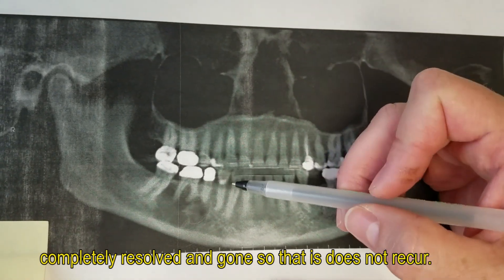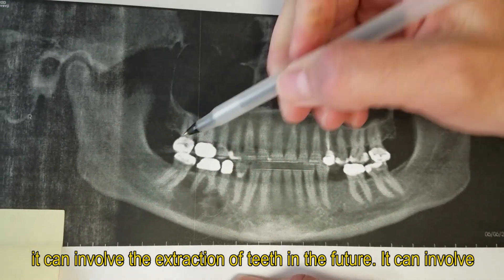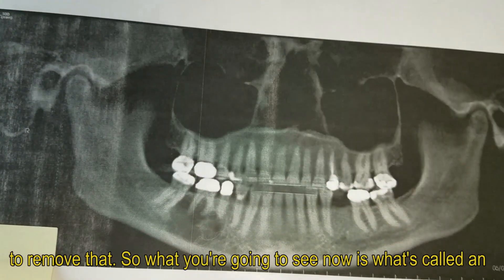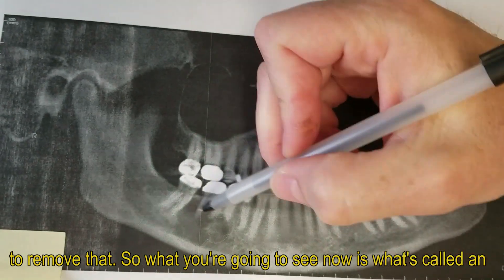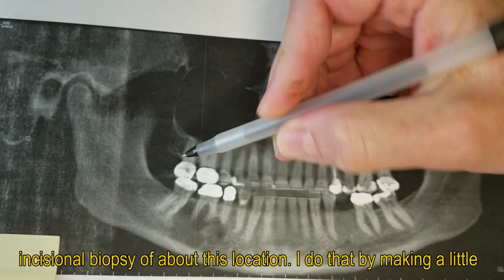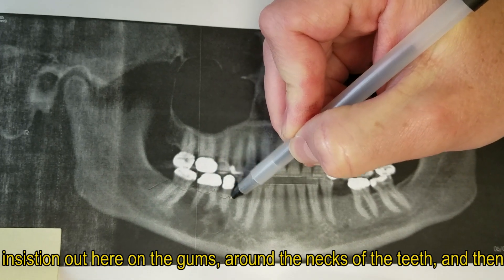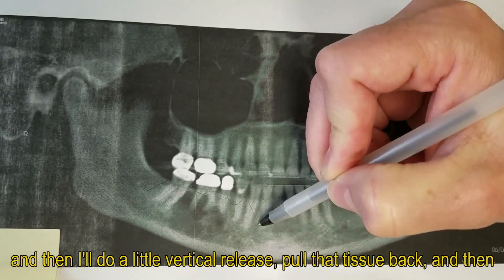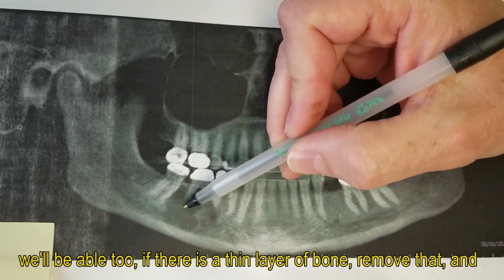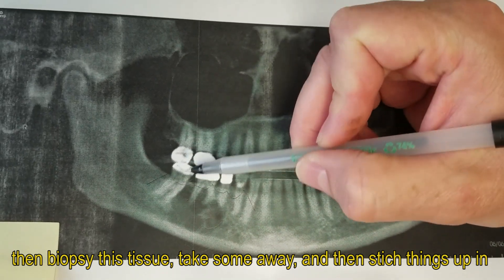So that it doesn't recur, treatment can involve the extraction of teeth in the future, or it can involve actual resection of the jawbone in this area. What you're going to see now is what's called an incisional biopsy. I do that by making a little incision out here in the gums around the necks of the teeth, then a little vertical release right here, pull that tissue back, and if there's a thin layer of bone we'll remove that, biopsy the tissue, and stitch things up.